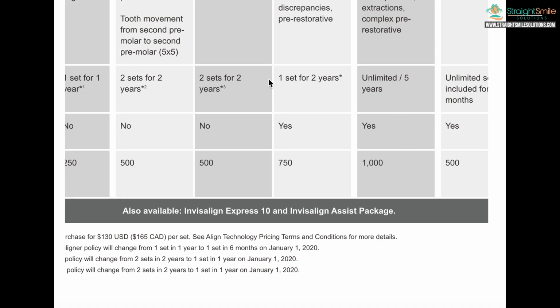There's all kinds of apps and systems that you can use to check in weekly, making sure they're totally tracking, not progressing unless the aligner's tracking, using their chewies, not moving forward unless you give them the thumbs up. So use a turnkey system like dental monitoring, use another system like GP Ortho Tracker, GP aligner tracking system. There's all kinds of stuff you can use.